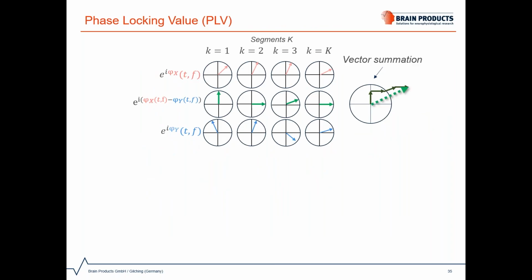It is not based on the raw wavelet coefficients, but on the wavelet phase. The wavelet phase is also a complex coefficient, but the amplitudes are all 1. I use a shorter notation here that you might also find in the literature.